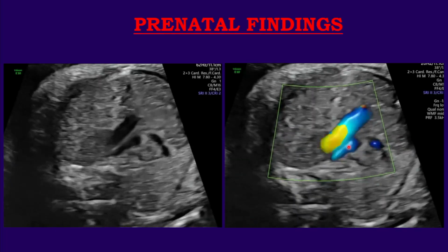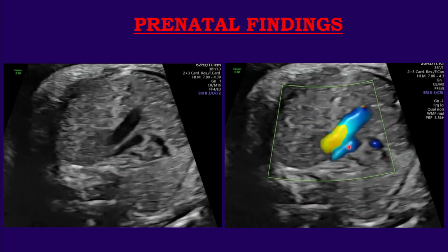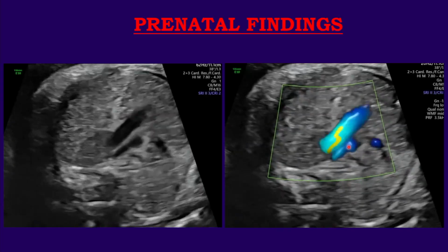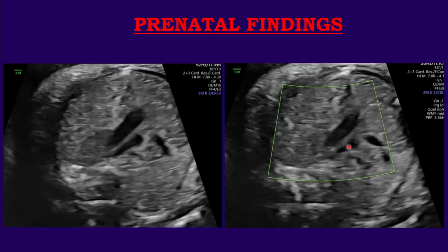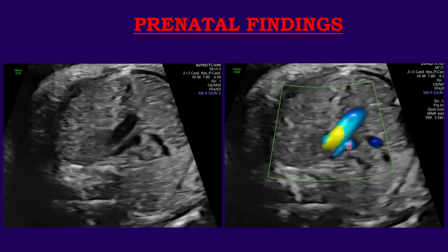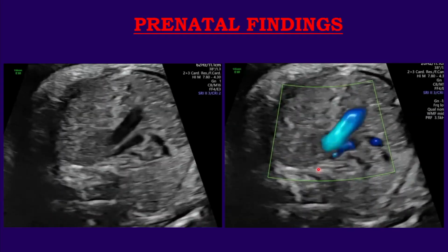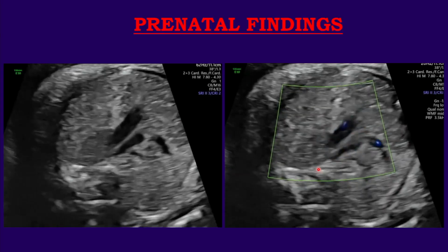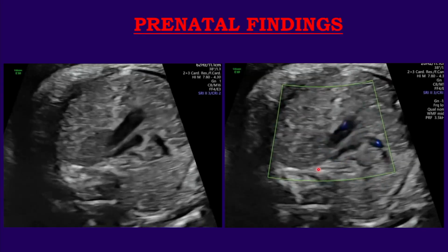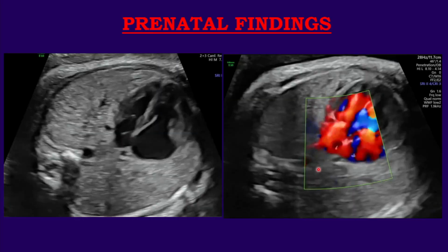the aortic isthmus. Now let's pause for a second and think why you can see the discrepancy in the size of the left and right chambers of the heart. You can observe that in growth restriction alone, but also in other pathologies, and then you have the combination of the growth restriction and you can also visualize the reverse flow in the aortic isthmus, because that would be due to the remodeling of the cardiovascular system and adaptation to the hypoxemia that occurs in growth restriction.